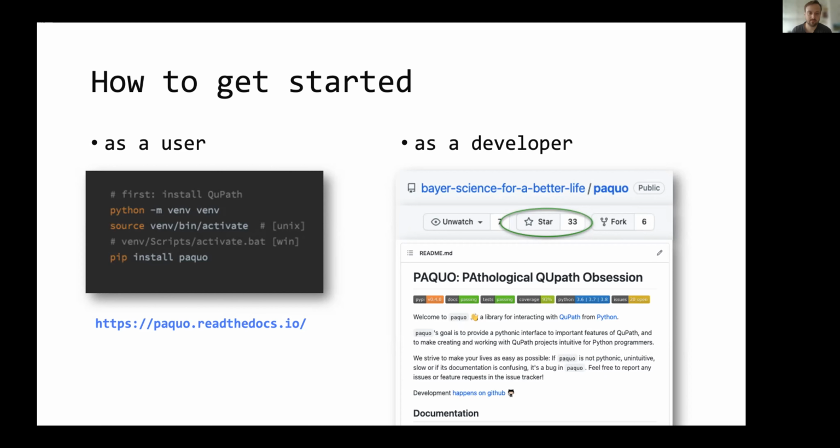For example, if it's like TMAs, full slide scans, other heavy images? So right now, for example, when you add an image to a QuPath project within Paquo, it takes the same amount of time it takes in QuPath to add an image. And for that, I think because it's either using OpenSlide or Bio-Formats on the backend, sometimes loading these 4 GB images takes a little bit.